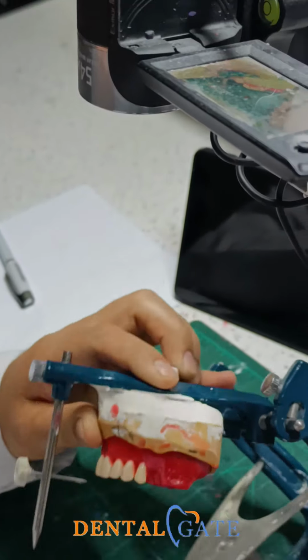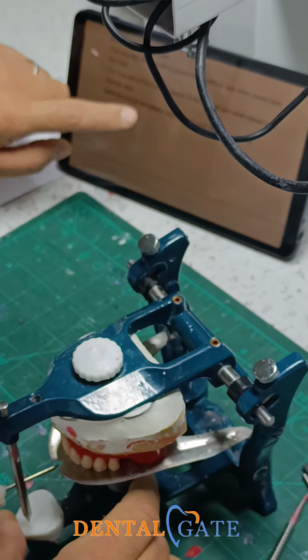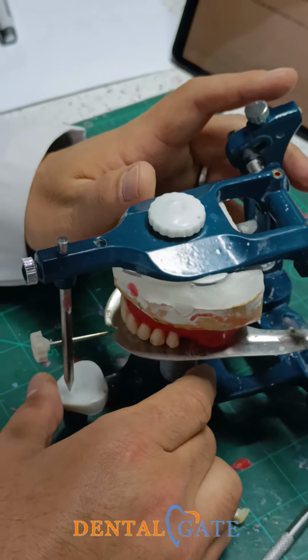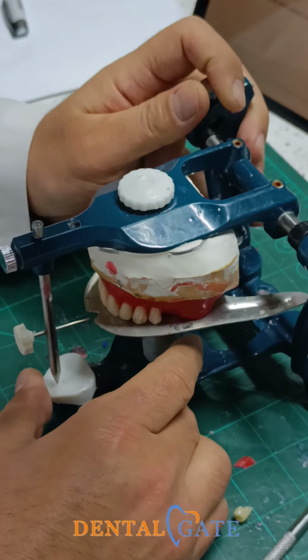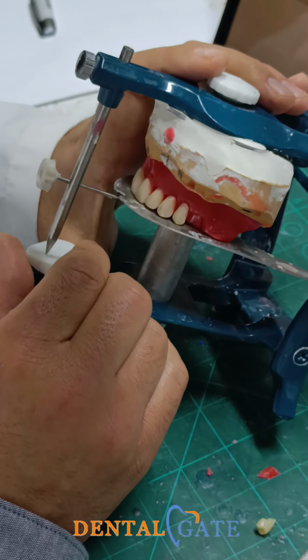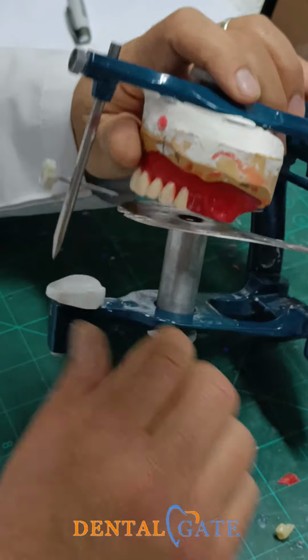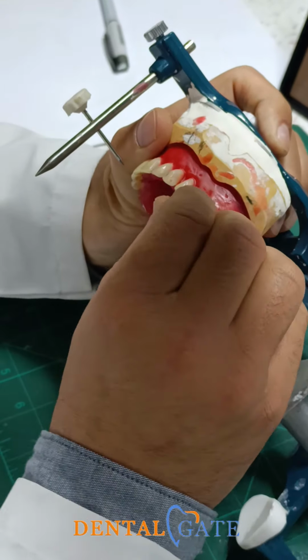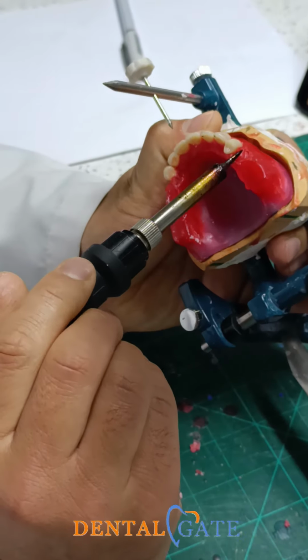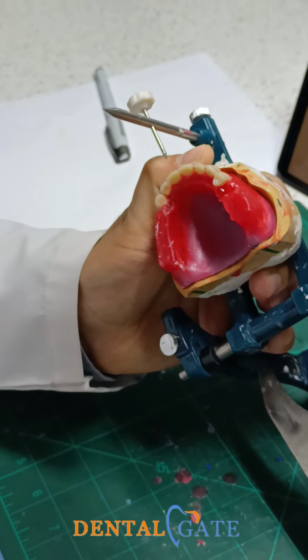What's the criteria of the second premolar? Same thing. The incisal edge should touch. The long axis should be parallel to the vertical axis, that's right. Regarding the cusps, both cusps should touch the table, okay? So the intercuspation will be produced by the lower. Yes, for the functional cusps. The lower should be arranged according to the upper, with one condition.